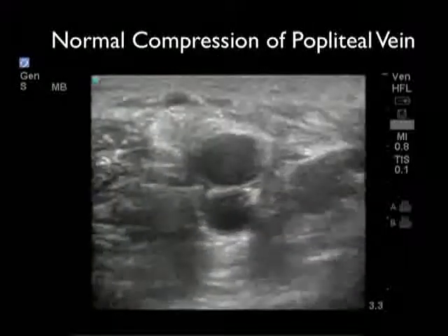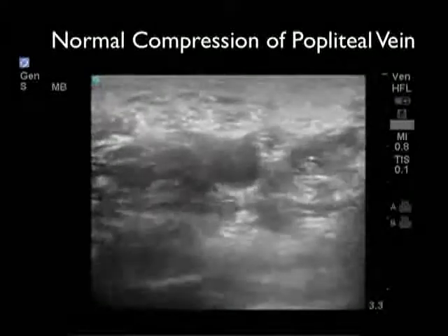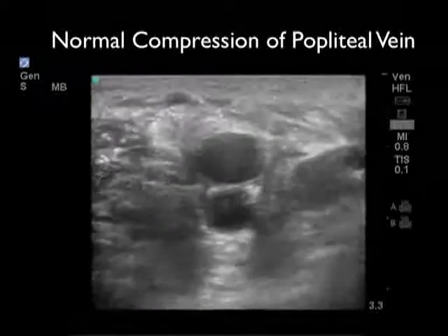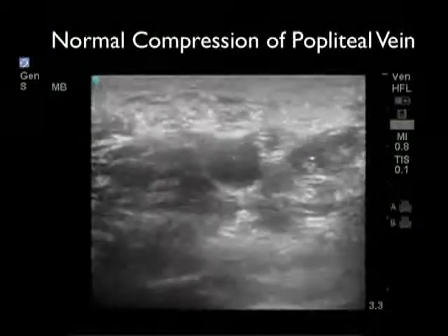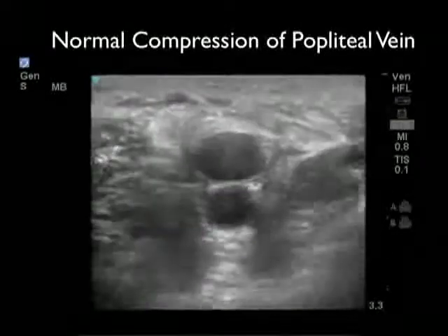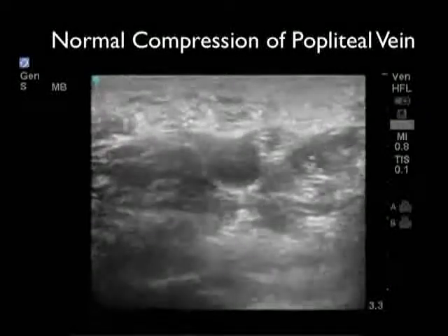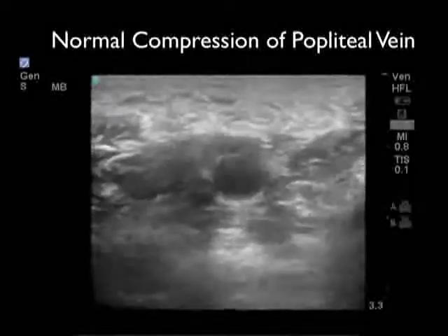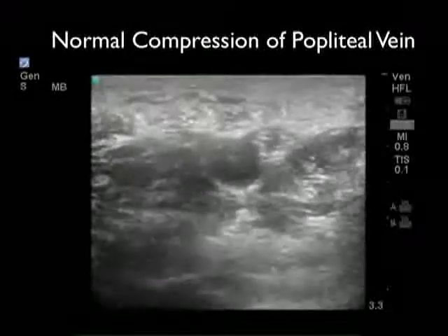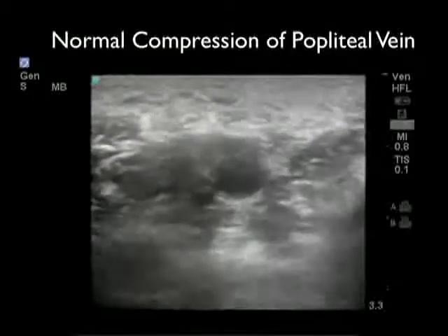Now let's move down the leg to look at the normal compression exam of the popliteal vein. Recall that the popliteal vein is going to be seen towards the posterior aspect of the image, or closer to the top of the image here, than the popliteal artery. As we press down, we note complete compression of the popliteal vein, and we see here that the artery still stays open. So again, this would be a normal compression exam of the popliteal vein with the anterior and posterior walls of the vessel completely touching down with probe pressure.